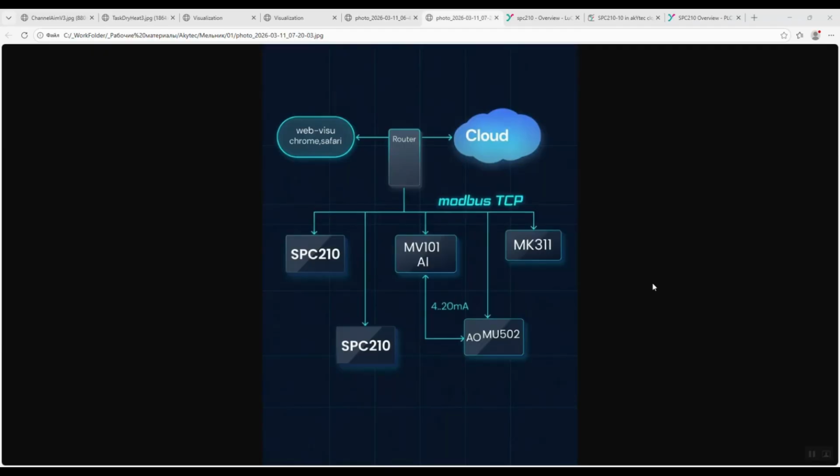A real sterilizer is quite expensive equipment, so we will not use it. Instead, we'll replace it with an emulator, a simulator built on another SPC210 controller, to which a MU210502 analog output module will be connected. The analog output of this module will be connected to the analog input of the MV210101 module and will be used to simulate temperature changes in the sterilizer.